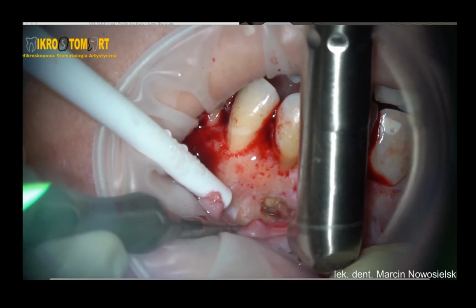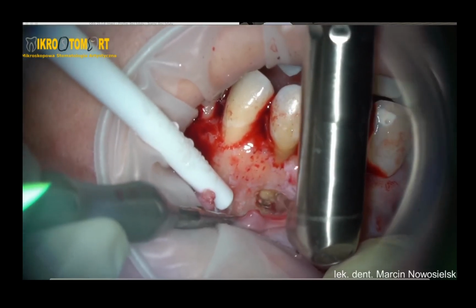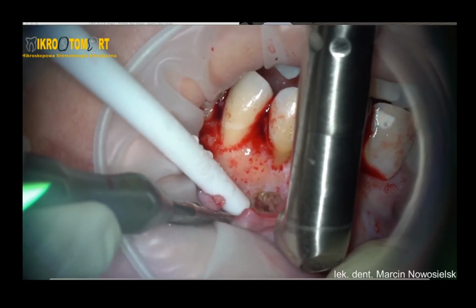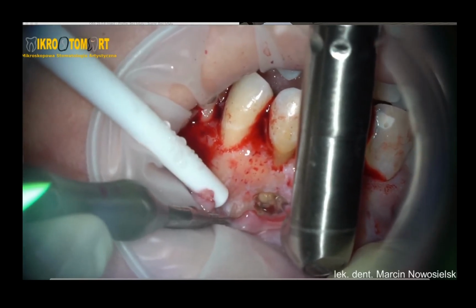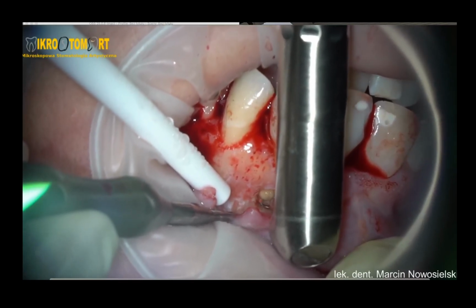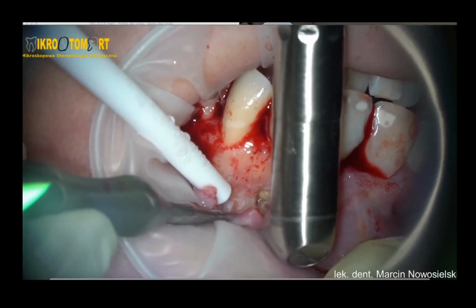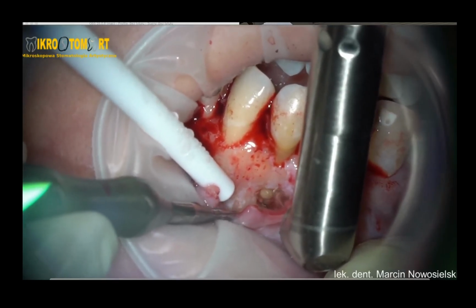I think the most important is the safety, because as you can see, with the laser I am unable to hurt the other tissues, so I cannot hurt the soft tissues, like I could do with a rotary instrument that could break the flap.